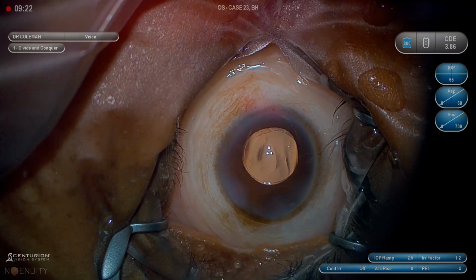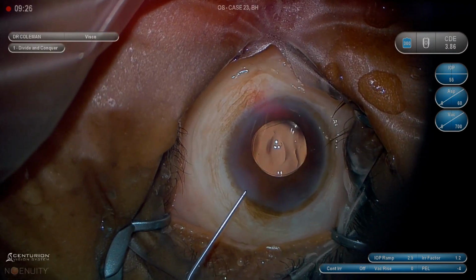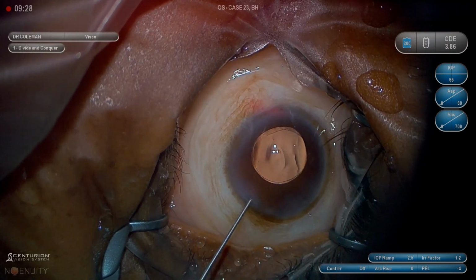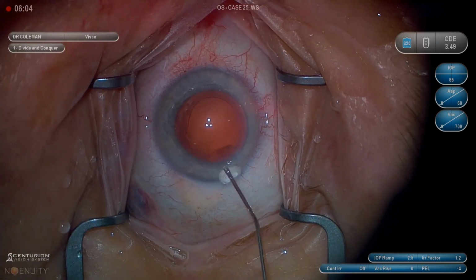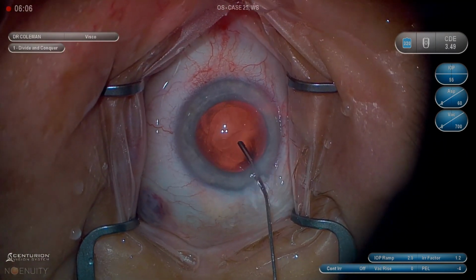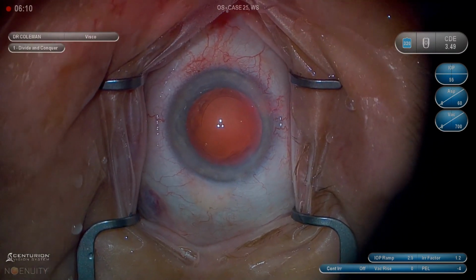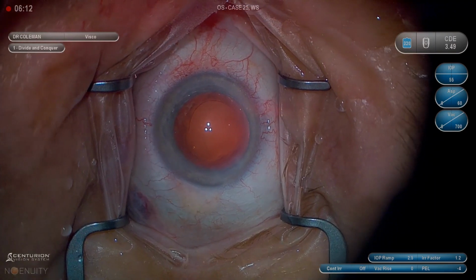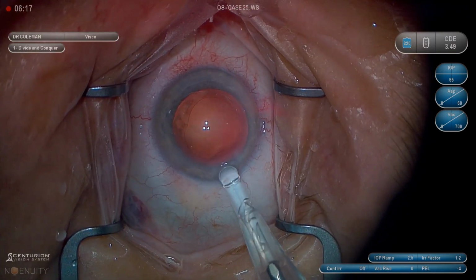Let's imagine you've got subincisional cortex. You don't want to push the lens, the IOL that is, distal to the wound to go try to get that. You want to bring that lens with you and preferably take a haptic over there, because that protects you from bringing posterior capsule forward while you're reaching underneath the surgical wound to get that last piece of remaining cortex. So I see people push the lens away. Don't do that. Bring it with you.